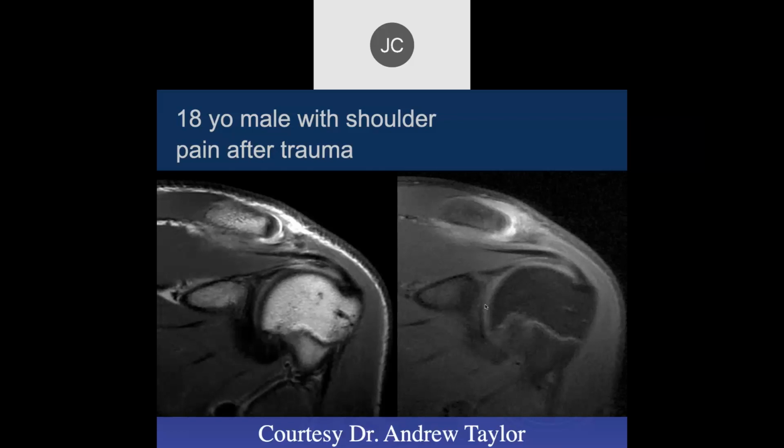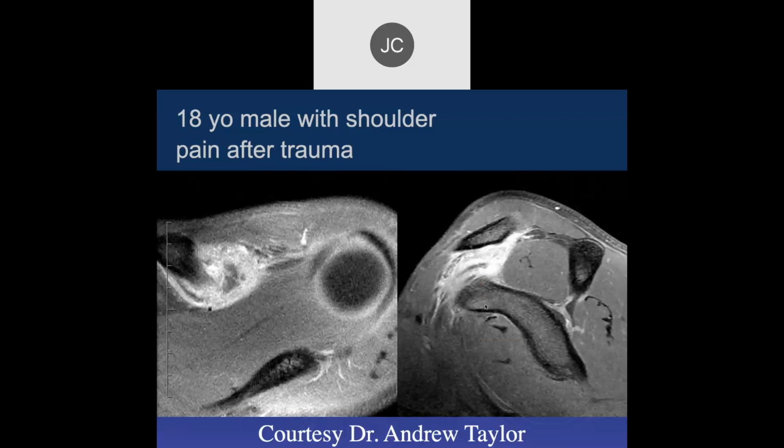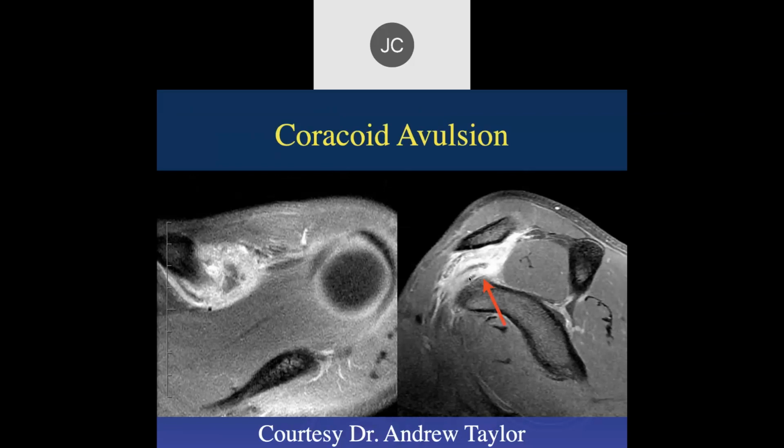So we have an 18-year-old with shoulder pain after trauma. Again, there's a lot of edema surrounding that AC joint and a tear of the capsule. It looks like there are complete tears of both coracoclavicular ligaments. What's that little thing right there? That looks like an avulsion fracture. And here are the sagittal images. Remember, 18-year-olds are still immature when it comes to bone maturity. So this is actually a displaced avulsion fracture from the coracoid process.